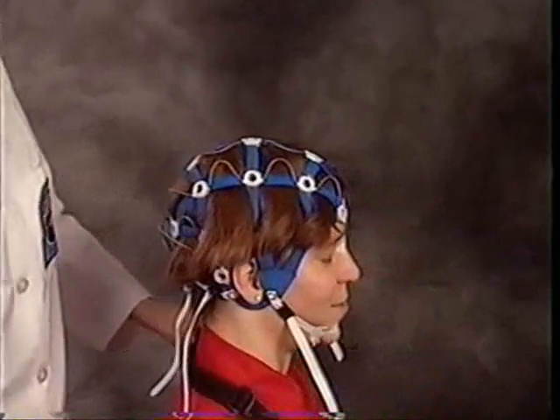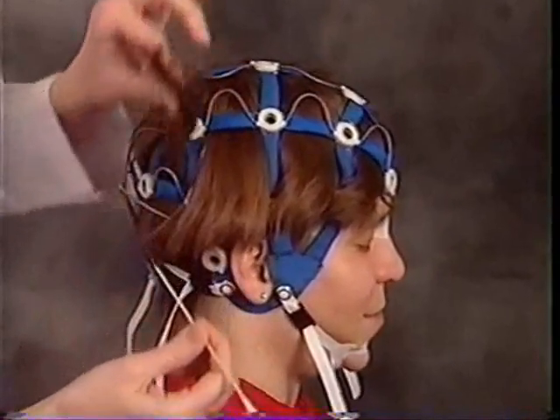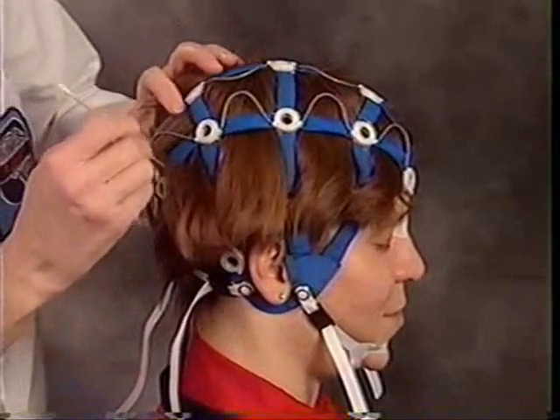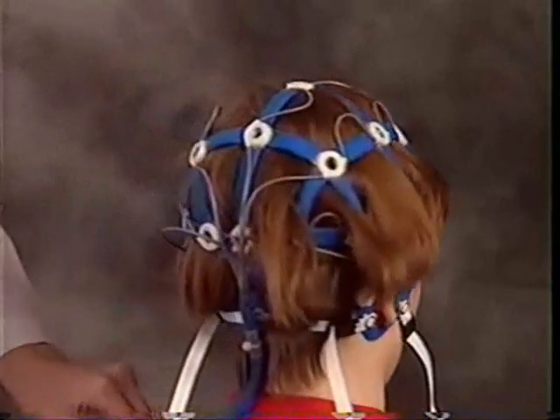Pull the hair through each section around the circumference of the Enet. Begin by parting the hair down along the side of the section, continue parting along the base of the section, finishing with a quick flip of the hair to pull it out of the section. Repeat this procedure for each section.